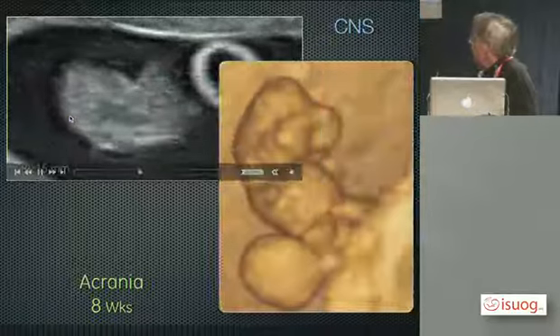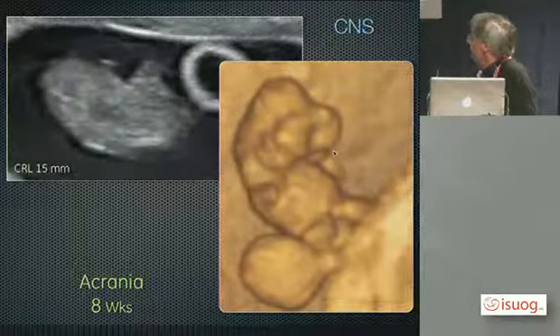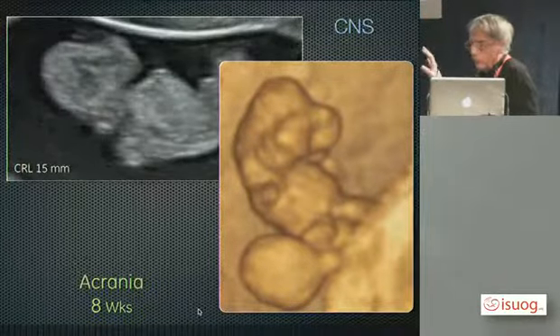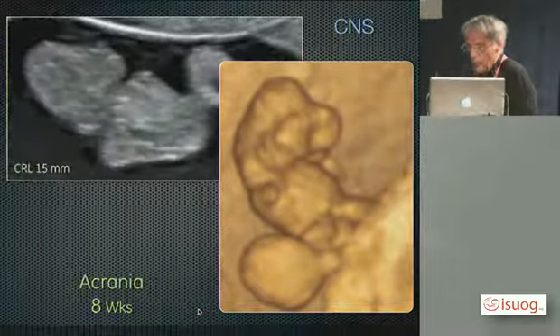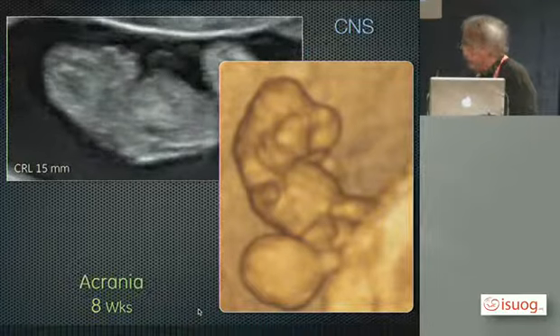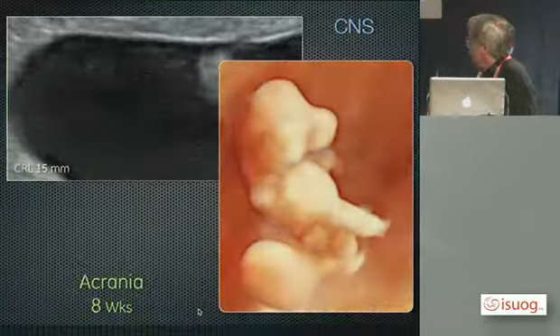This was a 3D rendering with the brain outside. This is a standard 3D rendering, and since last year, it's possible to apply a new rendering. The name is HD Live. It is this one.